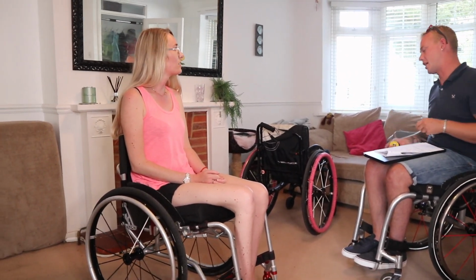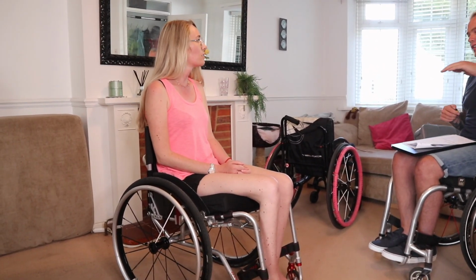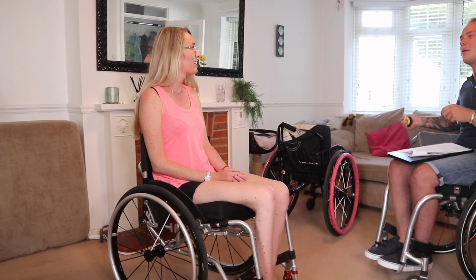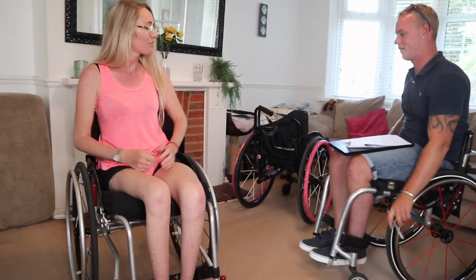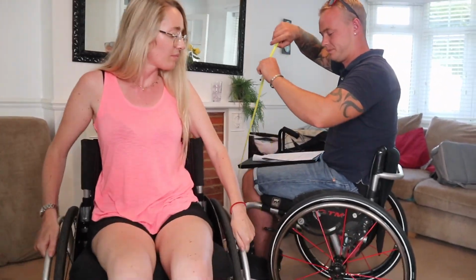Yeah. You've got this. Obviously, there's a bit more bucket to that chair, compared to your own chair. You even look like you're sat in it, or sat on top of it. Yeah, I definitely feel a lot more comfortable. Let's have a move around a bit. Right, I can take some measurements.